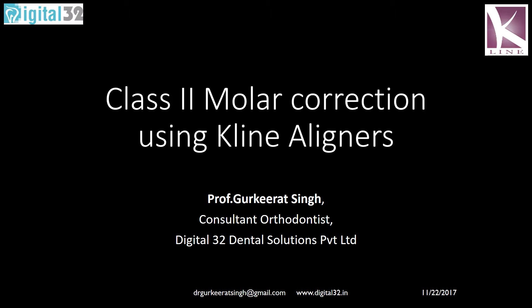Hello and we are back with K-Line clear aligners. Today we are going to talk about class 2 molar correction, which was considered very difficult even with conventional mechanics at times.